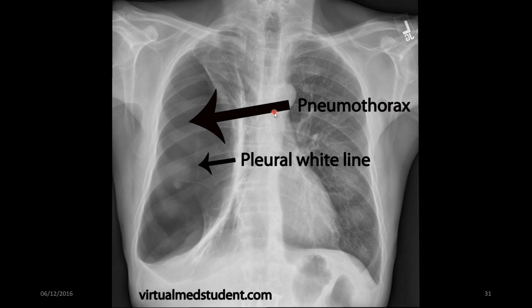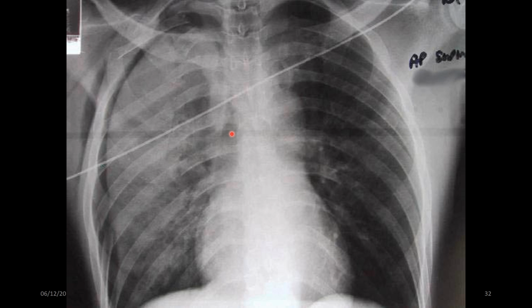I believe the next image is going to show us another clearly labelled pneumothorax, a right-sided pneumothorax there. So you've got all these lung markings that you can see on this side. They extend all the way across to the edge of the chest wall. But if you extend, there's a change in density, and the lung markings don't extend across there. What happens is the lung collapses because of a pressure differential between those two membranes, and so the lung can't correctly inflate. And that's why you get the absence of lung markings, because it collapses. It's a pneumothorax. Again, this is keeping in the theme with trauma.